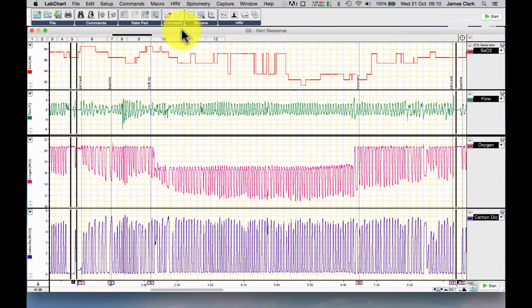Hello, this is a very quick tutorial looking at some data from a student practical where the students were breathing different concentrations of oxygen and they were looking at spirometry and end-tidal gases.